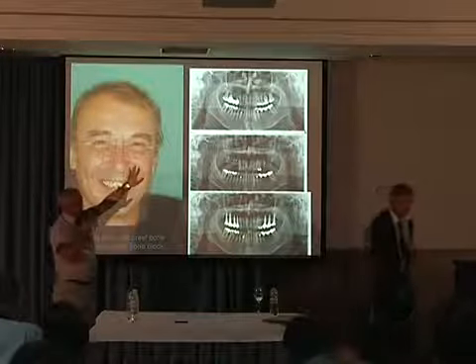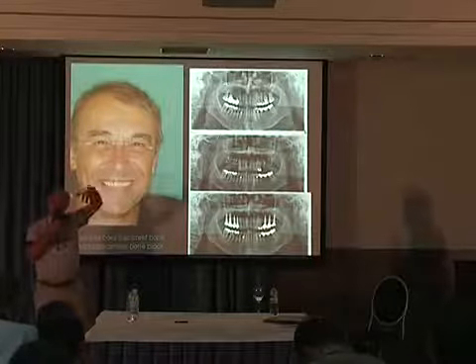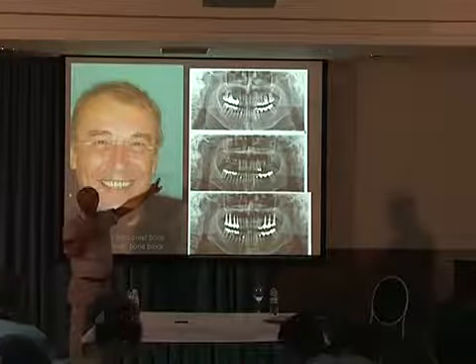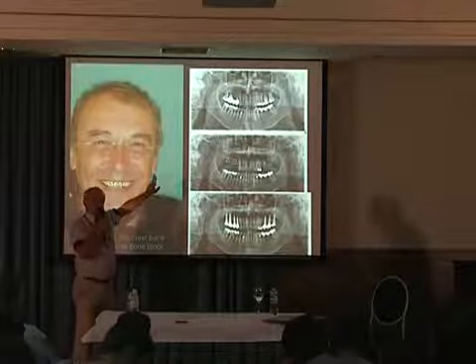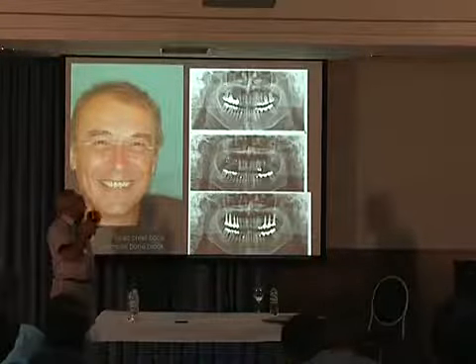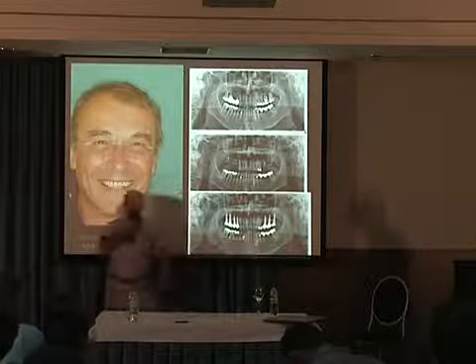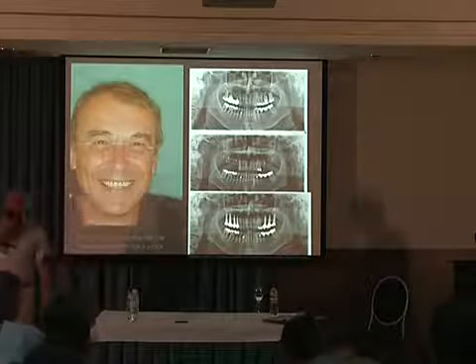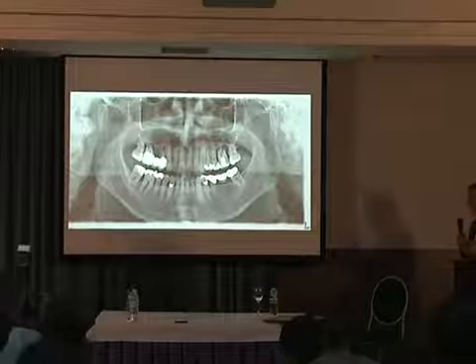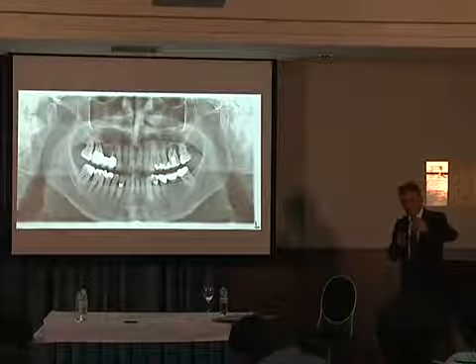Первая ситуация, которая была, вы видите старые мостовидные протезы, которые были на верхней челюсти справа и слева. Там и зубы пришли в негодность, и поломались протезы мостовидные, они были удалены. Вот здесь показаны пинами и винтами, где фиксированы блоки, полученные из гребня подвздошной кости справа и слева. И потом ситуация повторилась только на нижней челюсти, о которой он говорил. Сломался мостовидный протез на нижней челюсти, недостаточность костной ткани, и было предложено ему то же самое наращивание отростка нижней челюсти с помощью костных блоков. The maxilla I go over very fast, yeah?